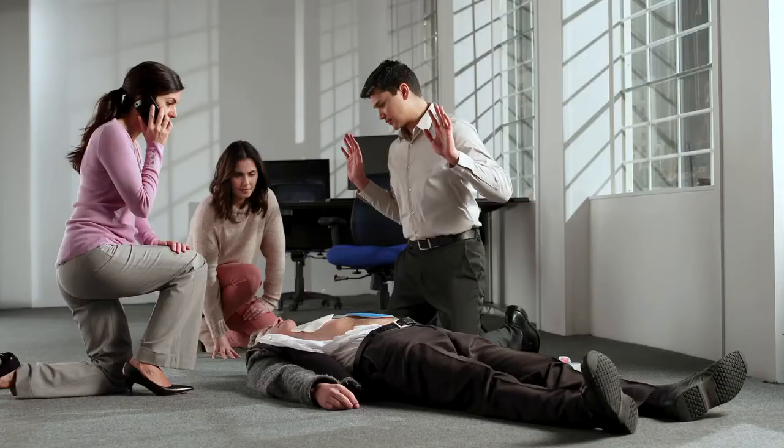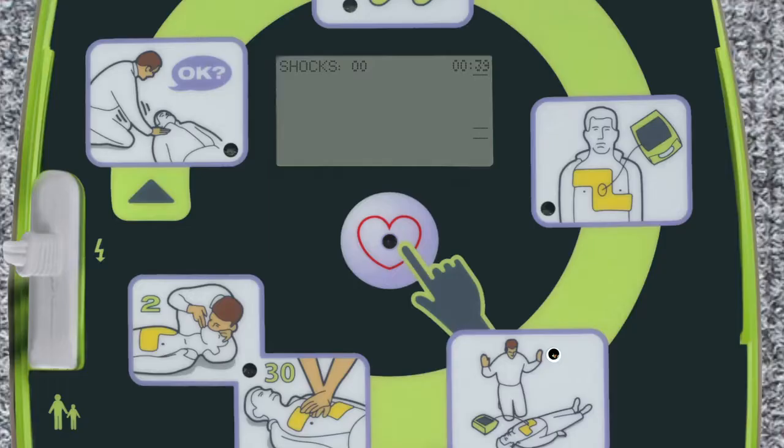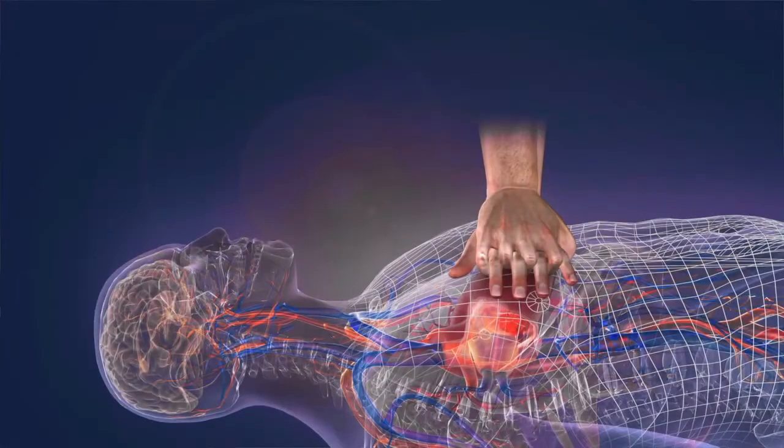Do not touch the patient in order to prevent interference with the heart rhythm analysis. The AED Plus analyzes the victim's heart rhythm to determine if a shock is needed. AEDs are safe and will not shock a victim with a normal heart rhythm. While only about 50% of cardiac arrest victims will require a shock from an AED on the first analysis, nearly 100% of victims will benefit from high-quality CPR.